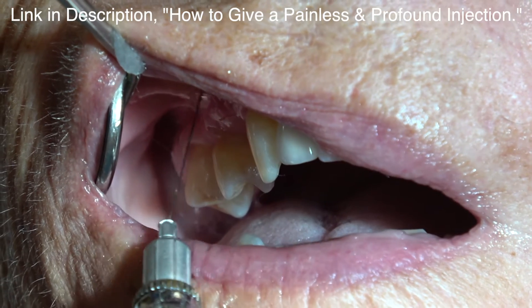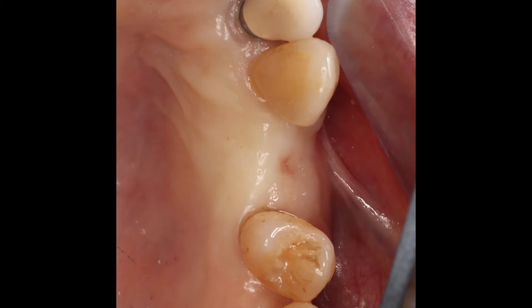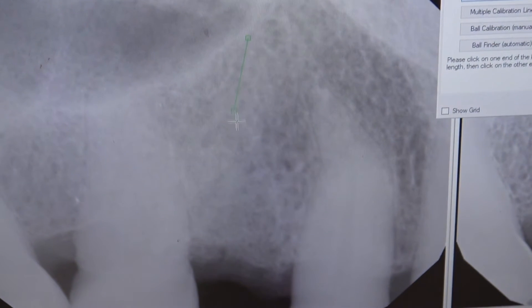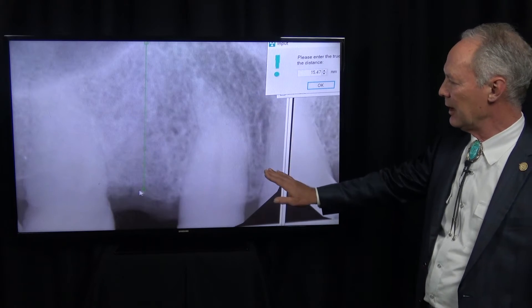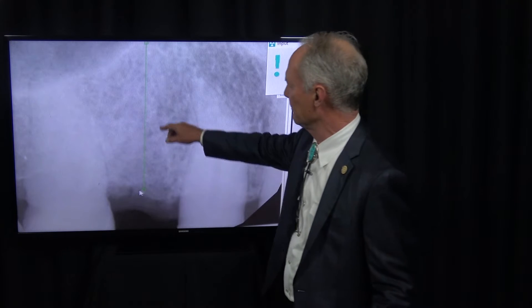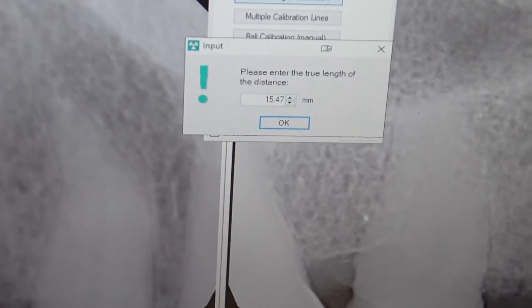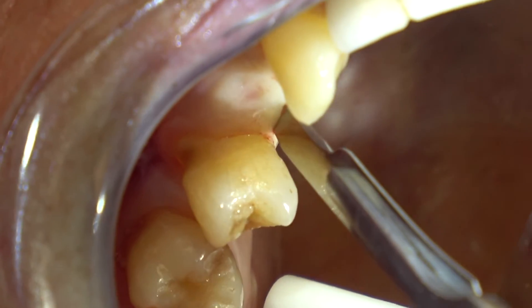Six months later — local anesthesia. You can see how this has healed nicely; there's a good wide horizontal surface. Here's the radiograph showing nice dense healing. We've got about 15 millimeters, so that's good. What I'm trying to do is slightly engage the floor of the sinus — that's good cortical bone and it creates a very stable implant.